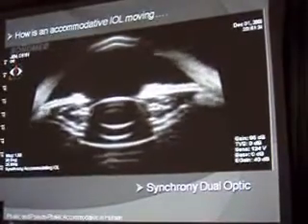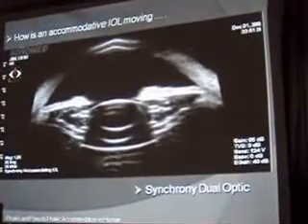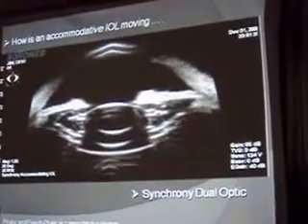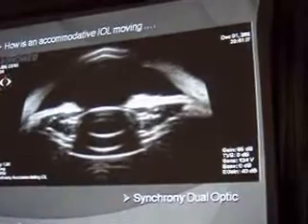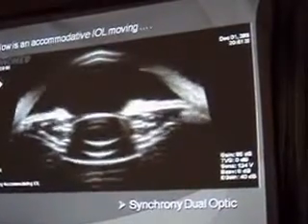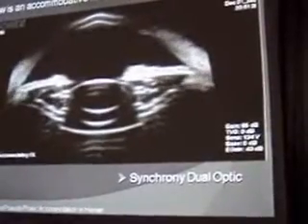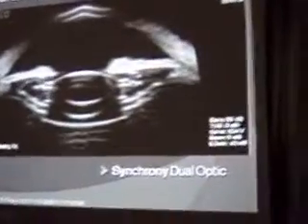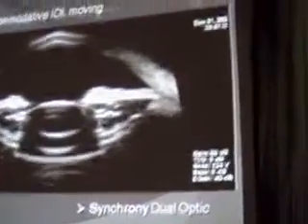They compensate each other, and the slight differences between the two lenses create like a telescopic effect, or the zooming effect you have on your photo cameras. This change of distance between the two lenses results in a very high diopter change, which justifies the near vision diopter addition that every patient needs.